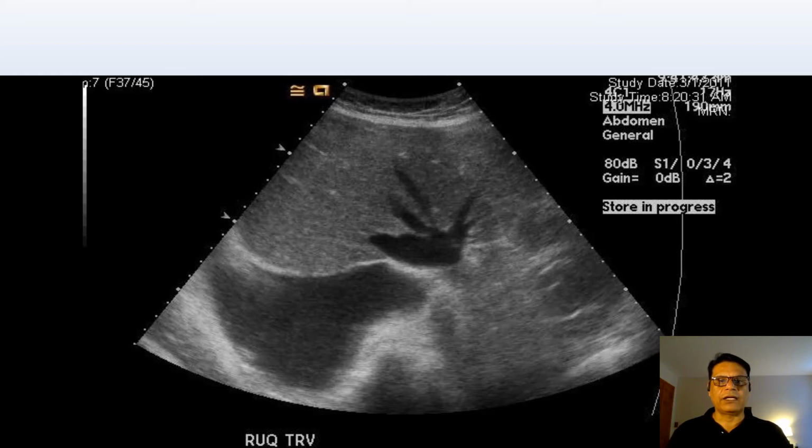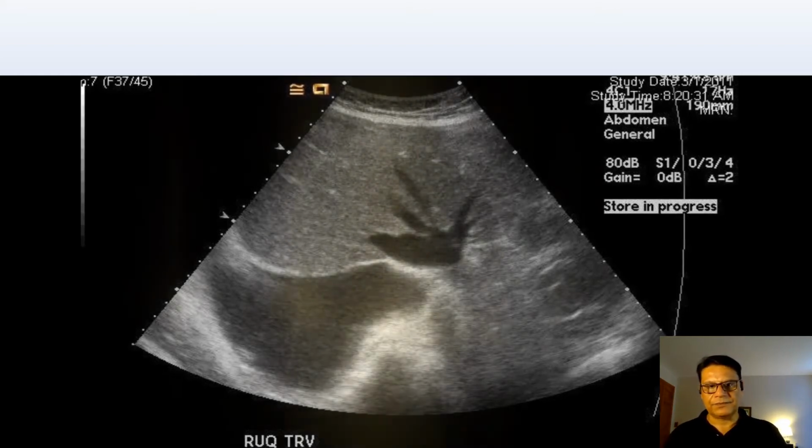And finally we get this type of ultrasound image, and it's called a grayscale image because you are seeing that it's almost all gray, and there are different shades of gray. At some points there are brighter points, and some are darker points. We will discuss this later.